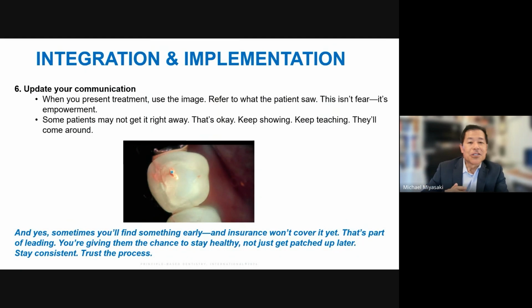When you present your treatment, put the images up. Like I put this image up and the patient said, oh, that spot right there that I had the blue dot over, we need to do something about that. And the patient said I had to do something about it because they could see the crack. I didn't even get to the point of having to tell the patient what we're going to do yet. So the patients, as you start to use something new, may not get it right away, right? But that's okay. Just keep using it.